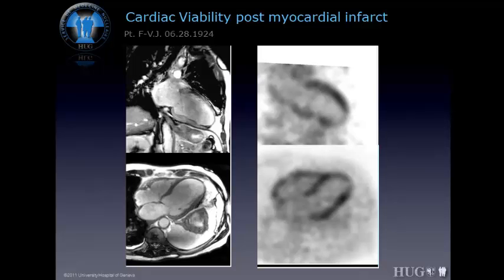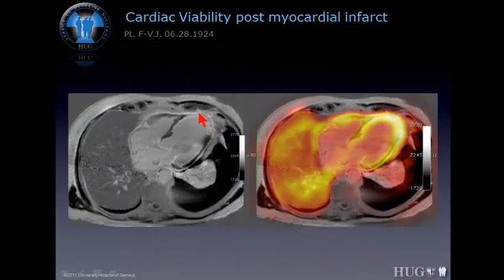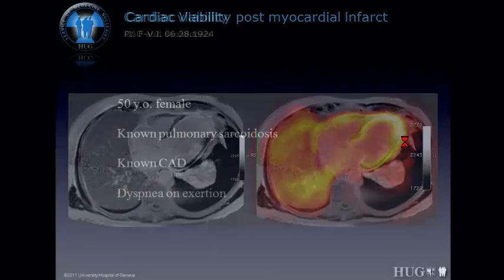One other patient, which was a very interesting finding for us, was this patient with a very probable anterolateral scar. However, when looking more precisely, we have this late enhancement in the apical region, but rather very much viability. So there was a false positive of MR, and we found very good viability in this region. I think Philip might also comment on that later on.